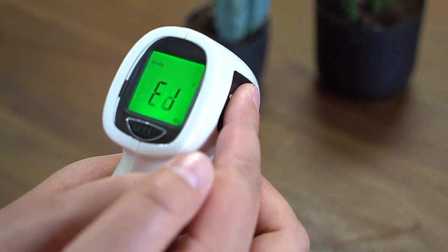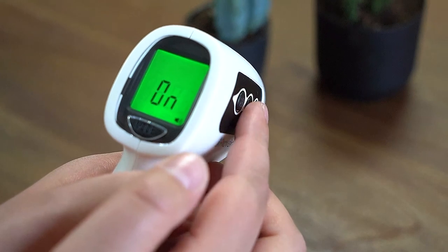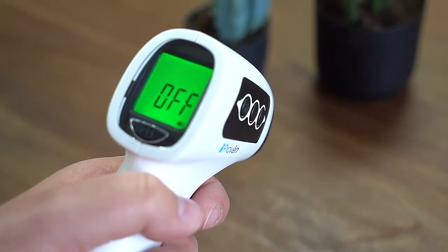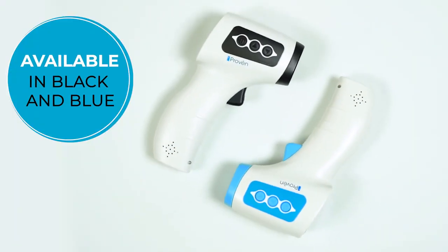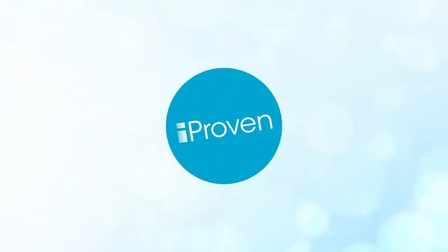Follow the same steps to mute the sound. Instead of pressing the set button once, press three times. You'll enter menu setting F3, where you can mute the sound. The iProven non-contact thermometer is the must-have for every household, available in both black and blue.